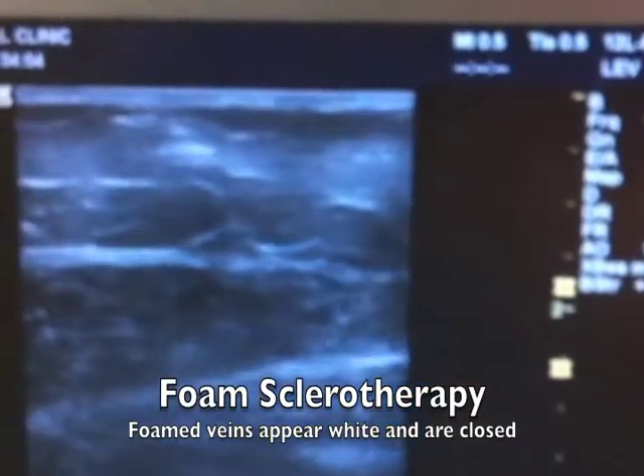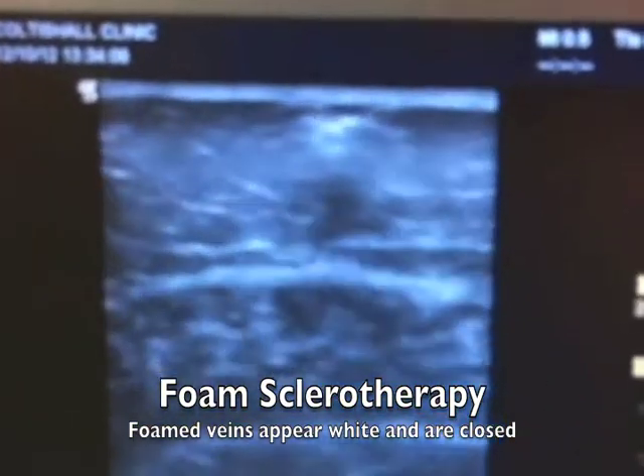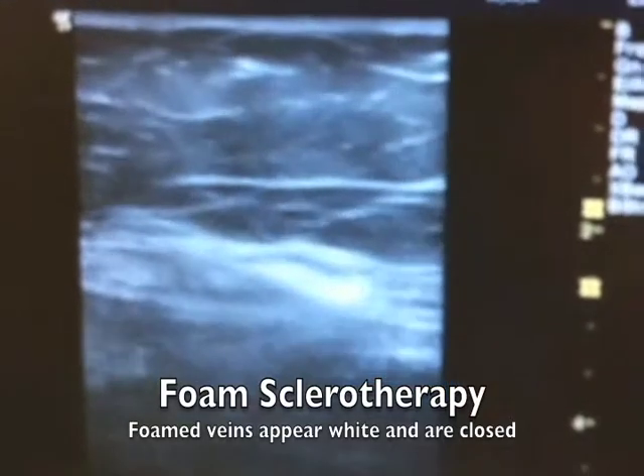That's the top end there which we have injected, and then we follow the foam all the way up. So it is dissipating now. All the foam going up into the thigh, into the main vein.